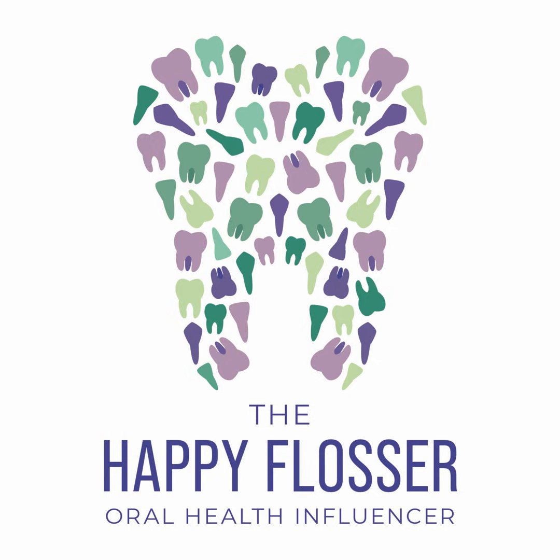So we want to make sure that we have accurate periodontal and caries risk assessments completed, and those go hand in hand with the interpretation of your radiographs. Those diagnostic radiographs actually support your findings when you come up with your risk assessment, both perio and caries risk.